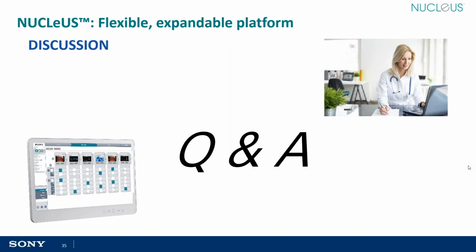Okay. The question is, are all the resolutions 60 Hertz? The answer is no. Pretty much any format that's out there, whether it's NTSC standard or European standard: 50i, 60p, 60i, 59.94. I know where this is heading because we had some limitations on some of our other products, but all the resolutions are not 60 Hertz. We're not limited to the frequency.